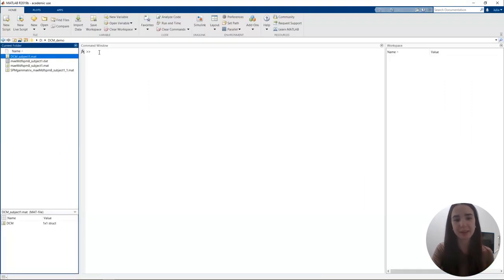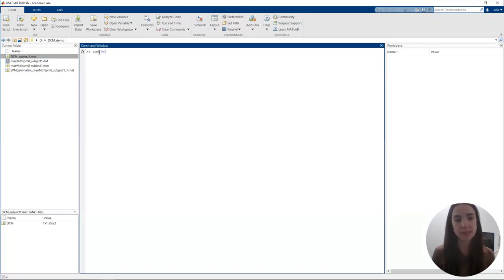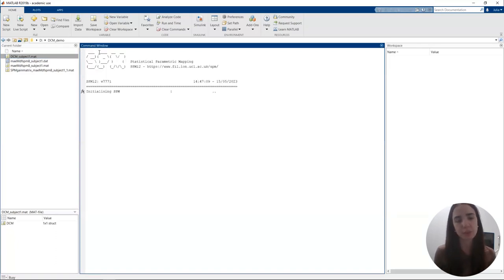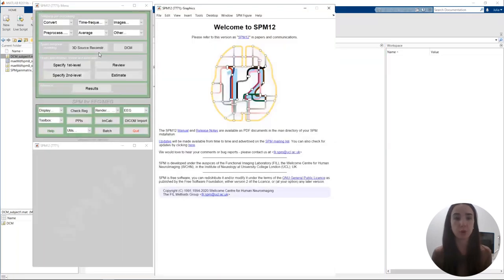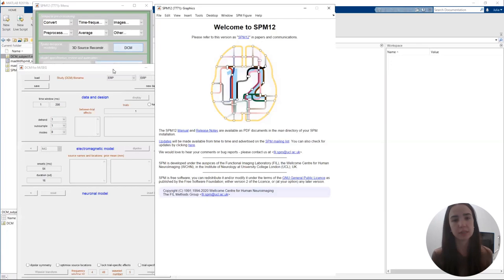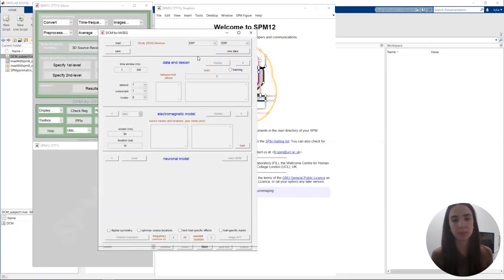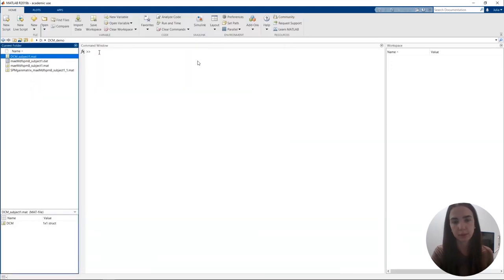We're going to start by opening MATLAB and then we'll type in SPM EEG to open the SPM GUI. Make sure that you have added SPM to your path and that you navigate to the folder containing your data before you open SPM. Then we click on the DCM button — this will open the DCM for EEG window that we'll be using to specify all the options and settings for our DCM.